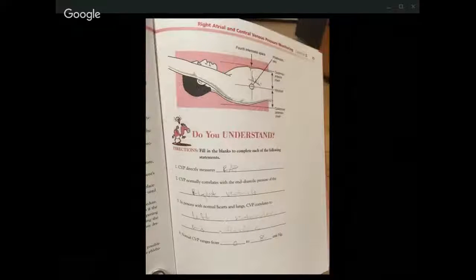So, we directly measure, from what I've read, the right atrial pressures. It reads indirectly the left heart function or pressures. CVP normally correlates with the end diastolic pressure of the right ventricle, which is also the filling pressure. In persons with normal hearts and lungs, CVP correlates to left ventricular end diastolic pressure.